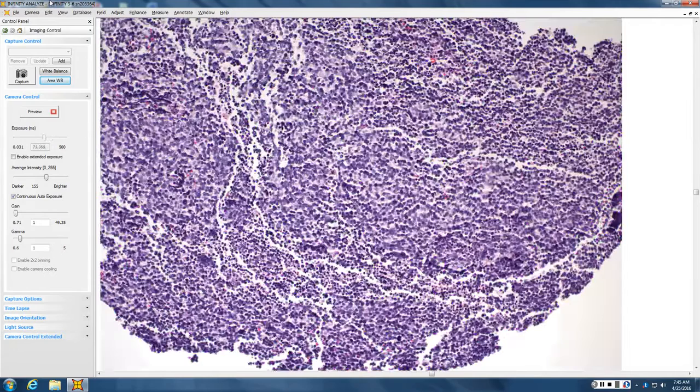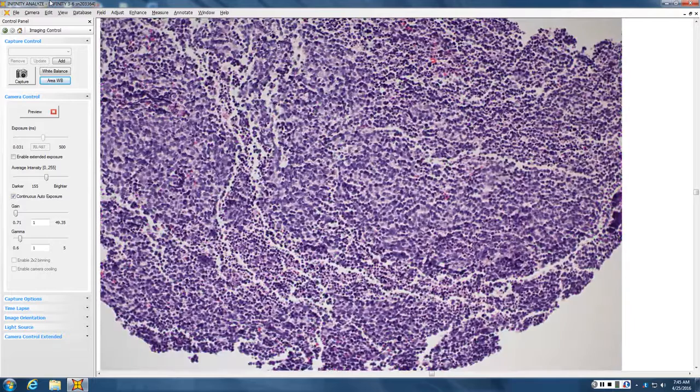Have just an unoriented chunk of cells. What color would you call them? Like a blue-gray. And are they particularly large, or are they more small blue cell tumor? So what's your small blue cell tumor differential? What do we normally think of in skin?